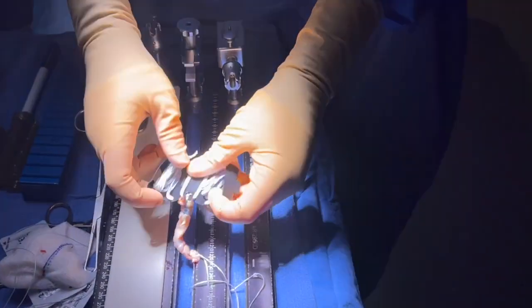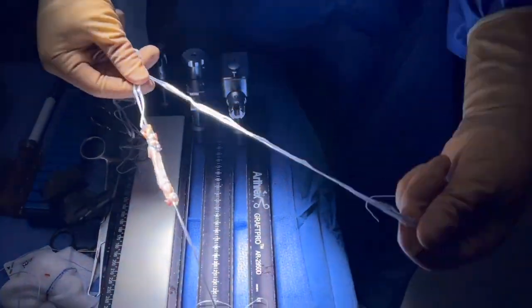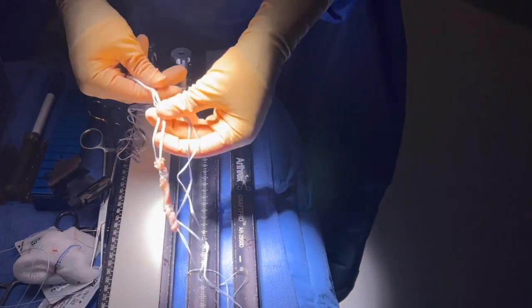You can see the clamp remains on there. And now you disengage the device. You can see that the newer device has a different button that sits better on the cortex. It's easier to pull through.